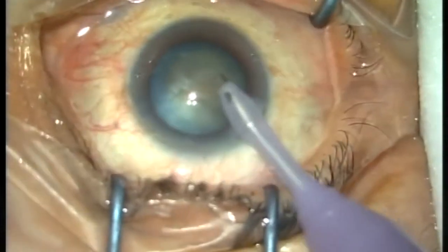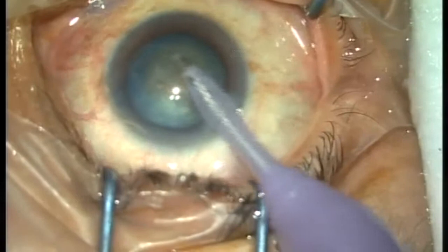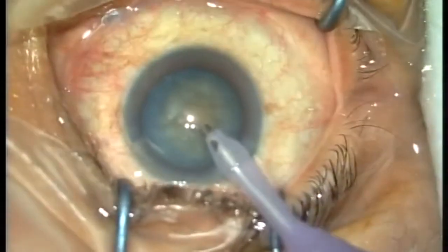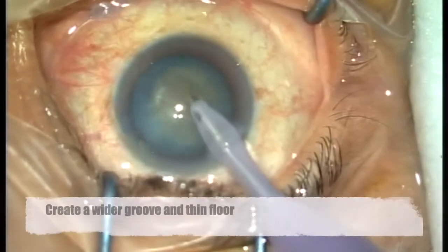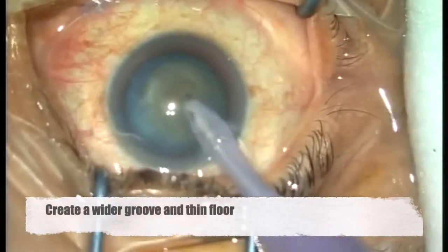During sculpting, we need to do a few things to improve the working space. We can increase the bottle height and create a second space by clearing the superficial part of the lens. Some people call this creating a second chamber artificially. At this juncture we were using linear vacuum of 90 mmHg and 100% torsional.